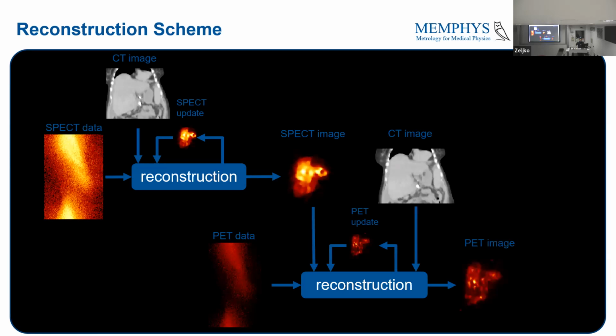Now you may be asking why on earth would you start with SPECT to improve PET? Obviously, yes, I did have the same thought. However, I found this quite interesting and something that no one ever investigated. Also, there was a logistical problem. At the beginning, we didn't have triple modality patient data, so we only had SPECT data, so that was kind of easy.